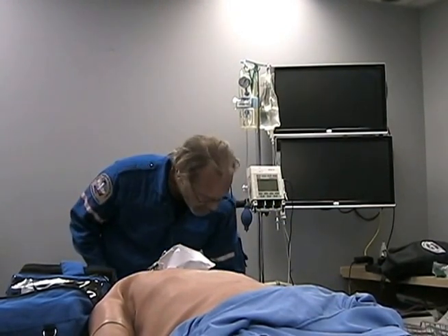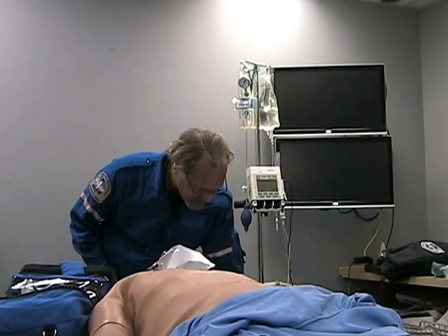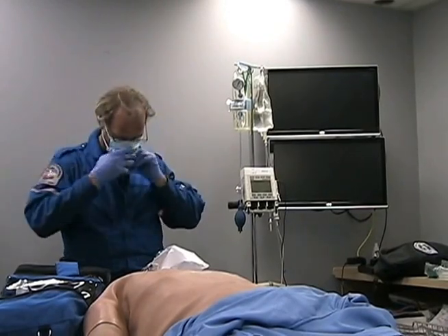Yeah, you know what? Here, hold on. I'll continue on here because it's going to take you a little bit. Okay. Where were you? Okay, RSI drugs. Okay, PPE. Okay, I'll get that. Are you okay if I continue on with this? Yeah. Can you hear me? Yeah, I think so. I mean, yeah.